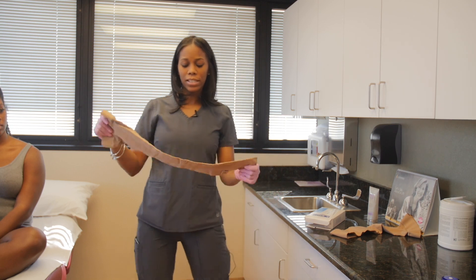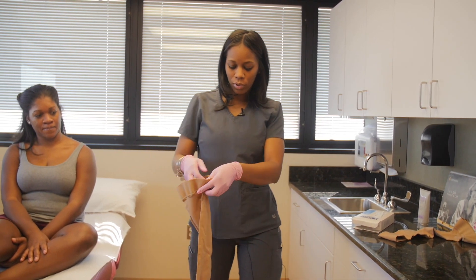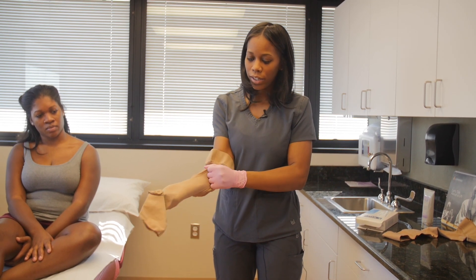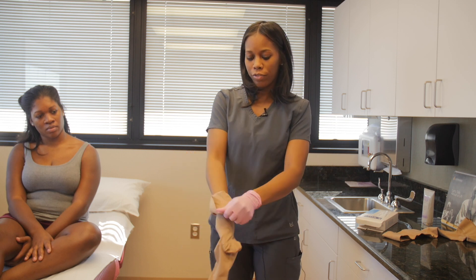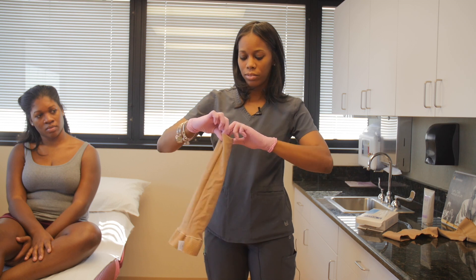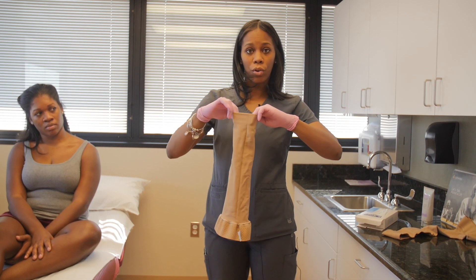What I usually do is I kind of stretch the stocking out a little bit and pull the stocking inside out. Starting from your heel here, I kind of grip it with my four fingers and pull it forward and keep the heel inside the stocking. You can kind of see the heel from the inside, from where you're going to start at.